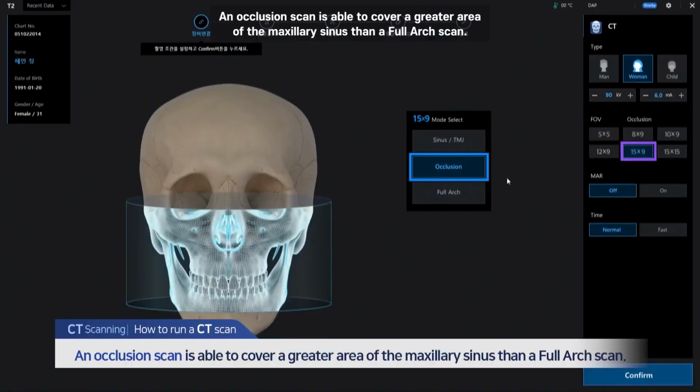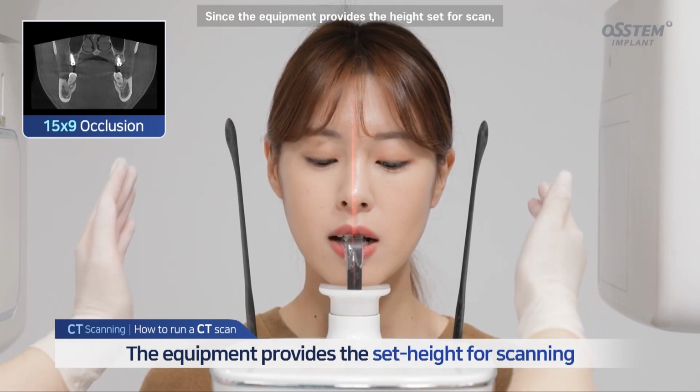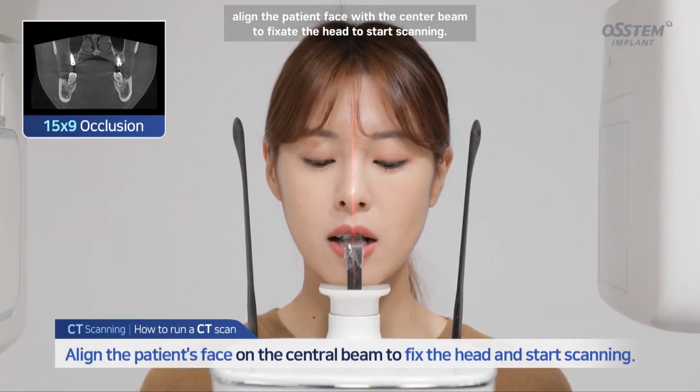An occlusion scan is able to cover a greater area of the maxillary sinus than a full arch scan, since the equipment provides the height set for scan. Align the patient face with the center beam to fixate the head to start scanning.